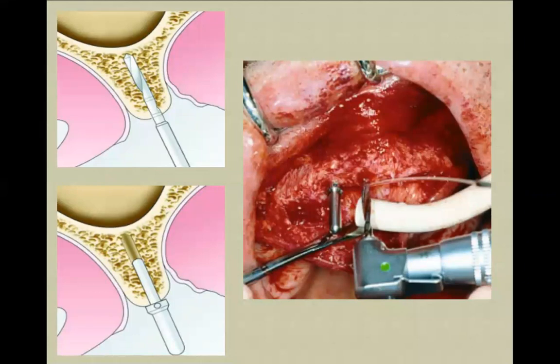It's quite thin, and its general aim is to determine the length of the implant, not the diameter, just the length. How deep can you place the implant? How long should it be? By means of this very tiny drill, you're just creating the initial hole.